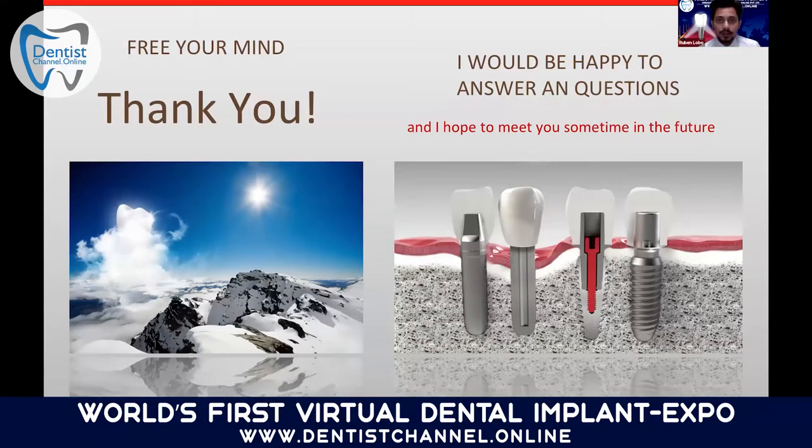What is the failure rate of an implant with a conical connection? I don't think one can say in general. It depends which conical connection, and was the implant placed, is it a conical connection that you can place subcrestally, and did you place the implant subcrestally? It's kind of the topic.